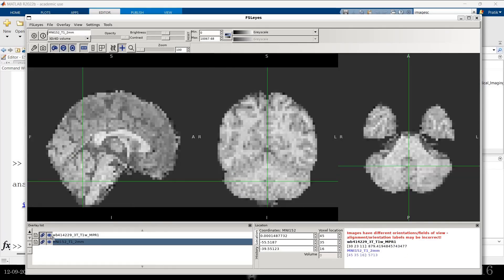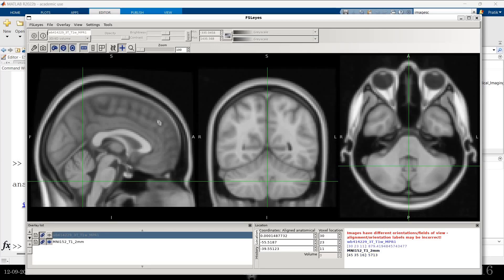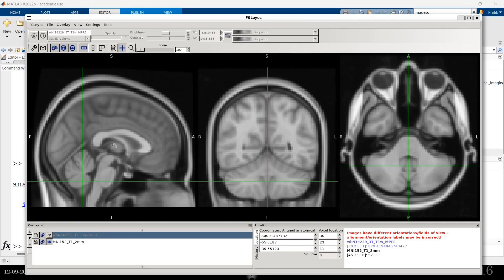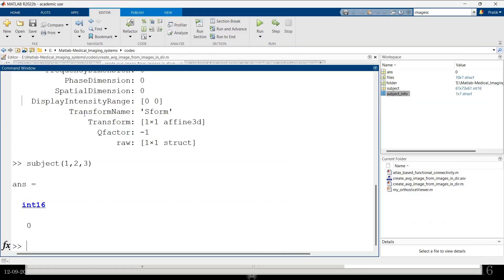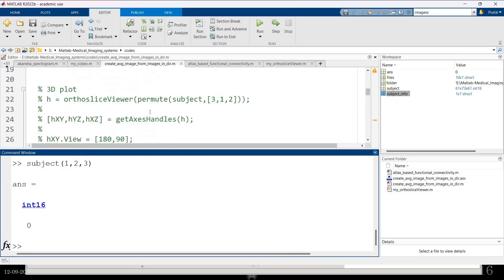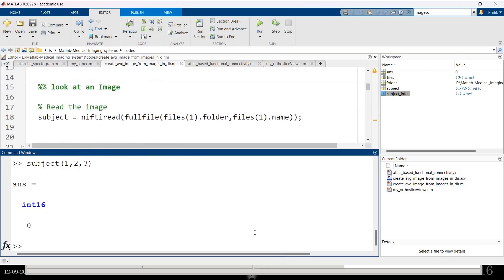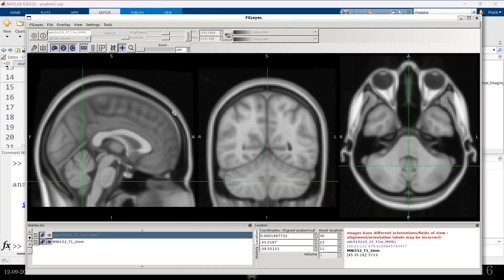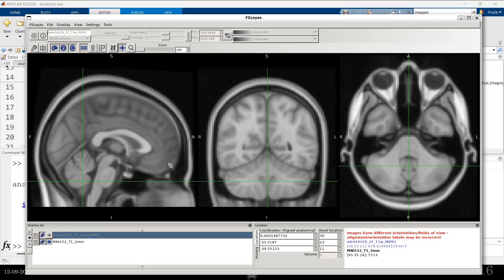Now this is the standard MNI template. This is how MNI template looks like. It's actually created using an average of 152 subjects MRI images. They also probably wrote a code like this to create an average. I don't think in MATLAB, but somewhere. And that's how they got the average. And that's how they said, okay, this is a standard template. Called MNI template.